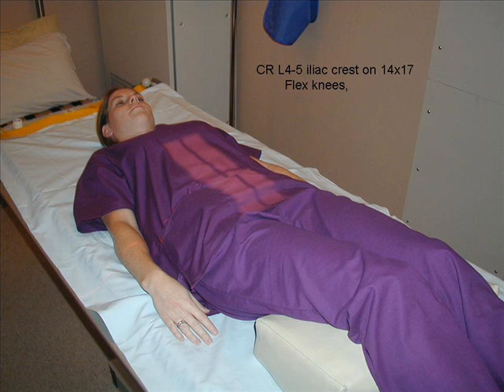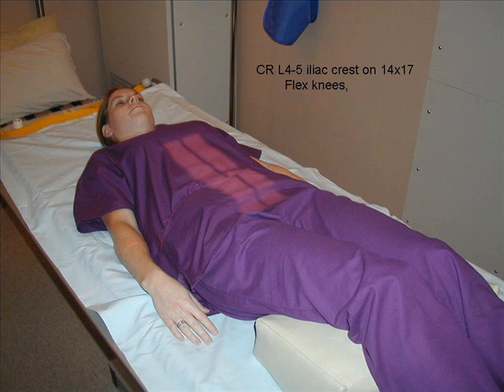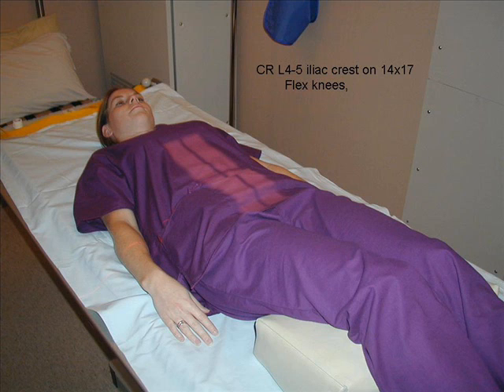The central ray is directed to the level of the iliac crest if using a larger image receptor, and one and a half inches above the iliac crest if using a smaller image receptor.